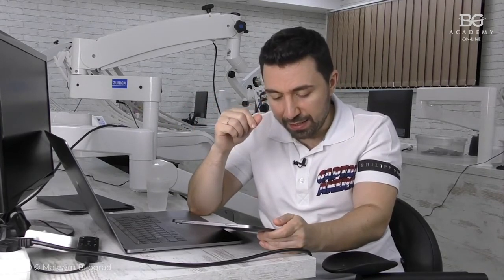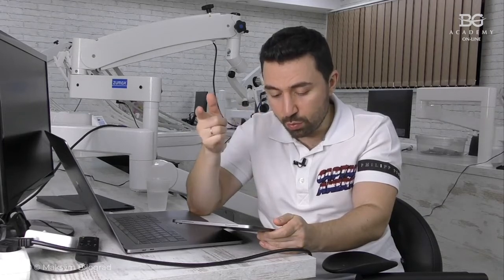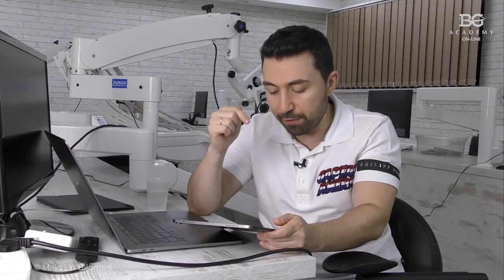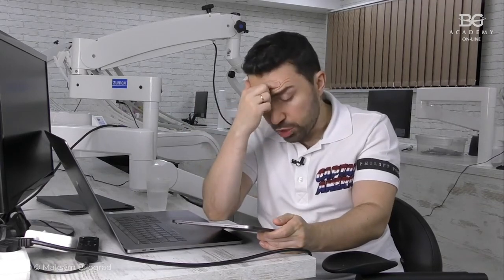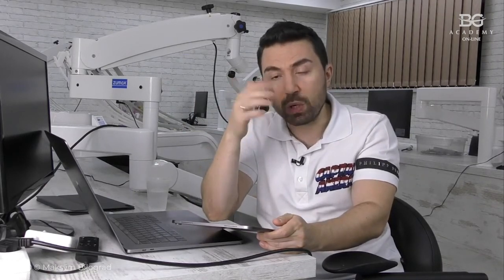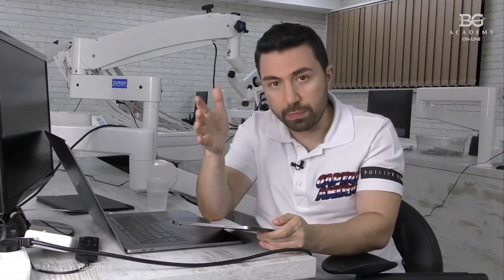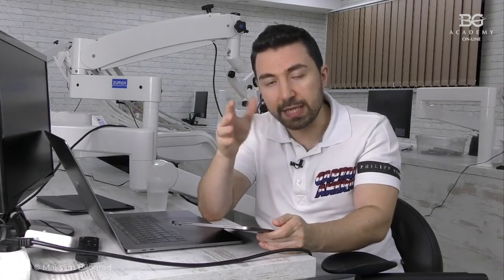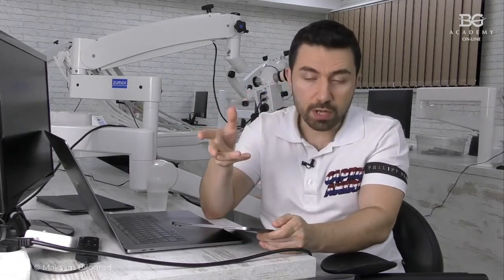If you do IDS, won't it be too thick a layer with the flowable cement as well? Actually, we do IDS when we prep teeth, during or after preparation. We do two steps of preparation, then IDS, and then a third step of preparation, when you decontaminate enamel and refresh your finish line.